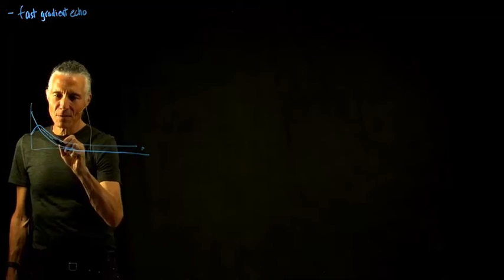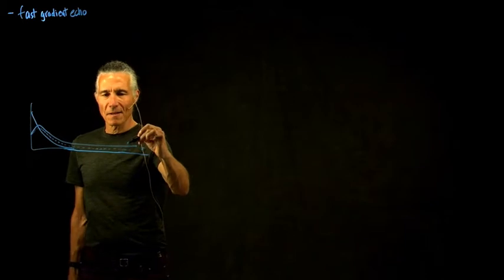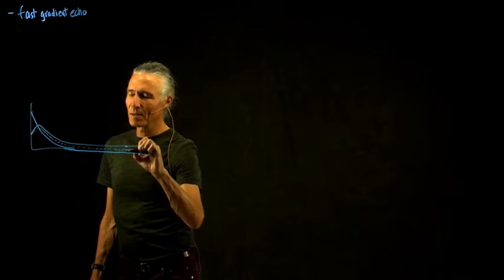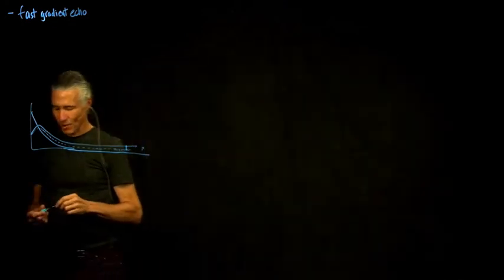more chance for the contrast between the two different T2 tissue types, and there'll still be enough signal to work with.